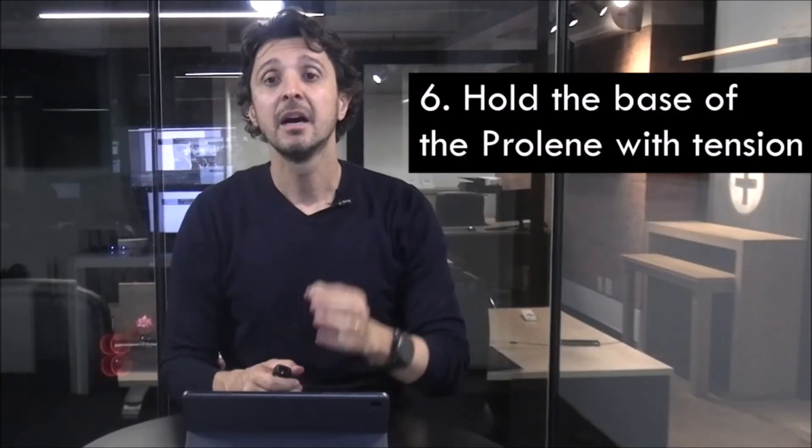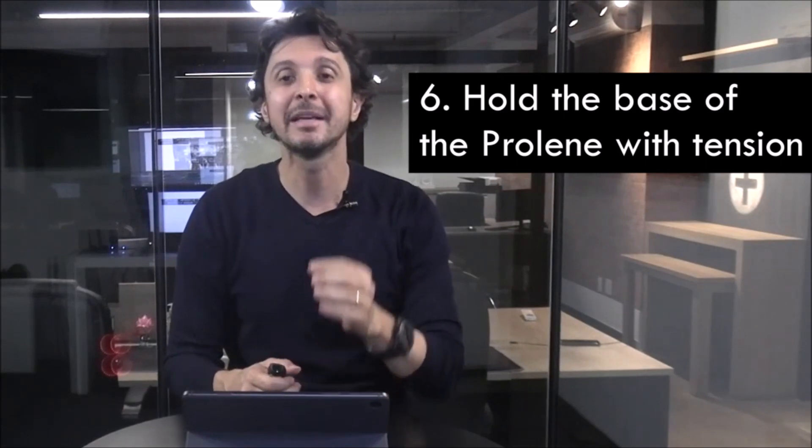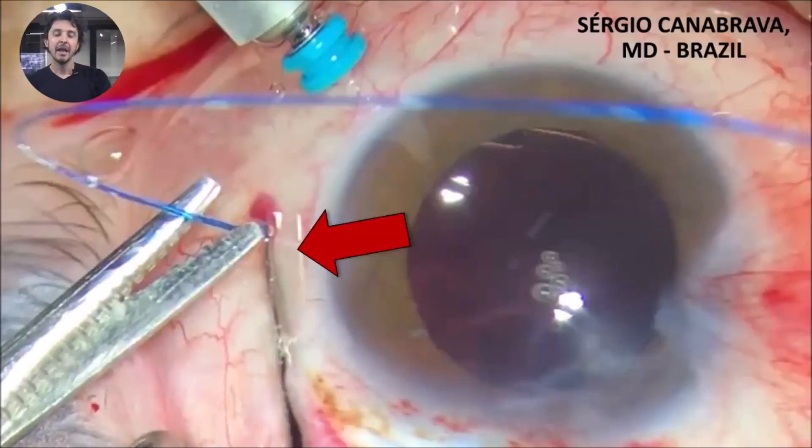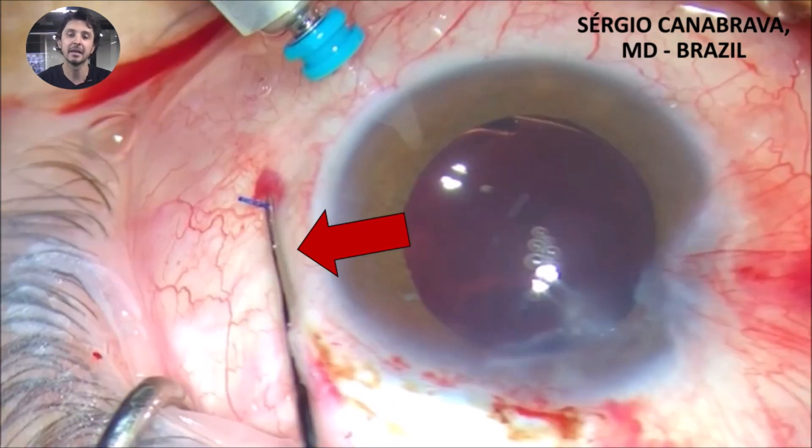Tip 6: hold the base of the polypropylene with a micro forceps to create some tension. Observe this image — the red arrow shows the 23 gauge micro forceps holding the polypropylene. Before this, I have pulled the polypropylene and held it at the base with the micro forceps and then cut it. It's important to avoid tilting the IOL, because the IOL and CTS can have no tension inside the eye and produce some tilt.